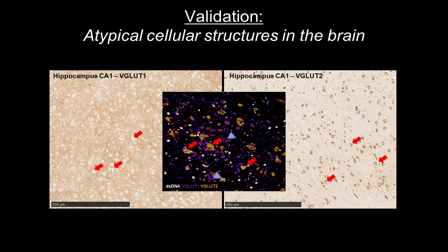And again, to know that things are working properly, you need to be able to stain these things and scan them at a reasonable resolution so you can see if something's perinuclear versus more diffuse in its staining pattern here.